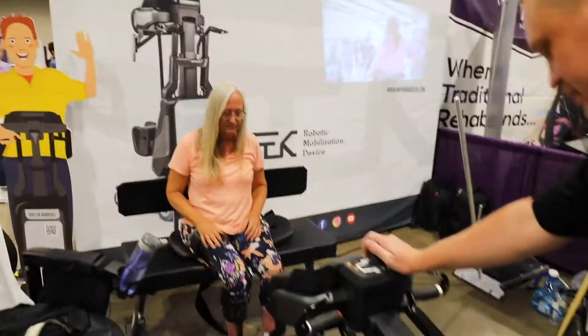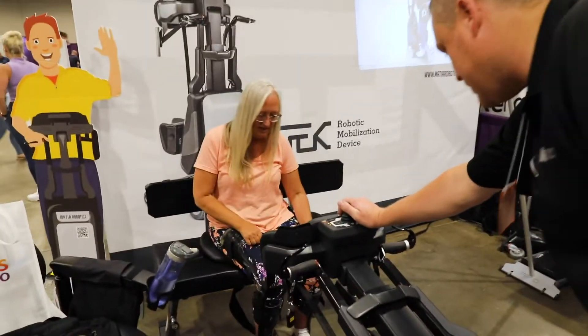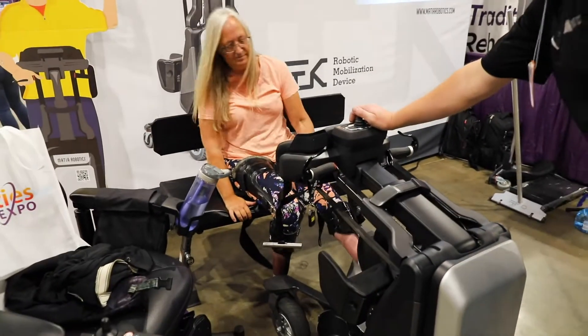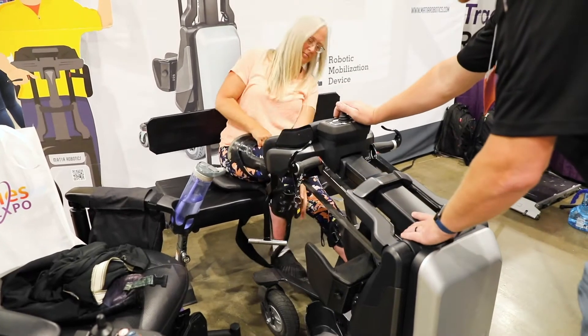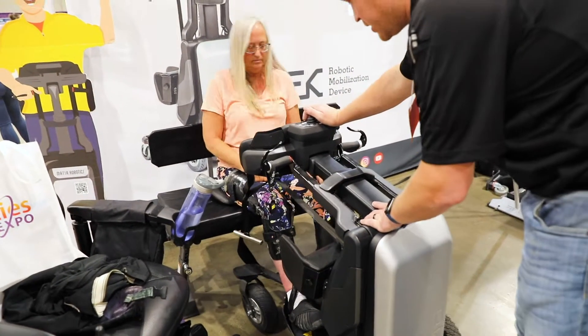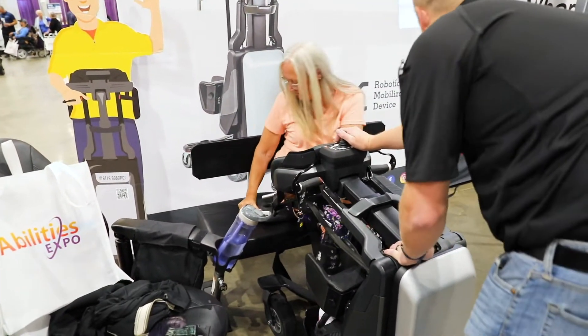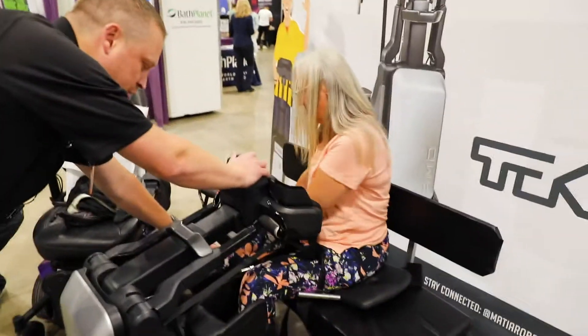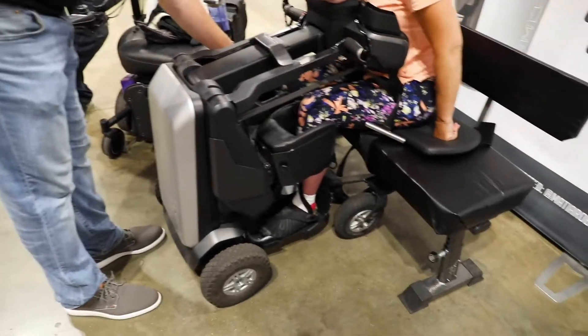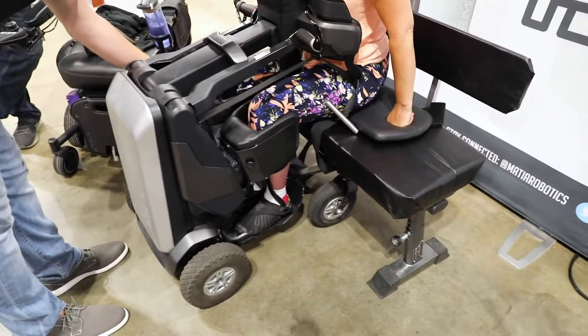I'm just gonna bring it back, nice and slow. I have to think backwards when I'm doing this, and then as I get back, it's a little higher to lift up your legs — that's because the outdoor wheels have more height to lower. Help me guide your knees right in here so we don't catch a brace. Perfect. So then we're gonna bring this back.